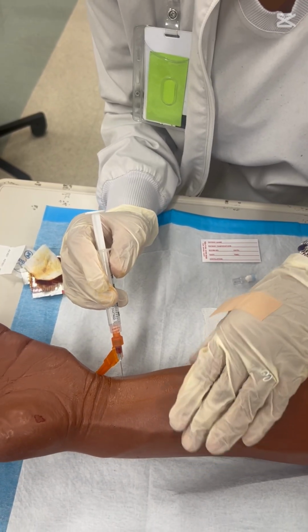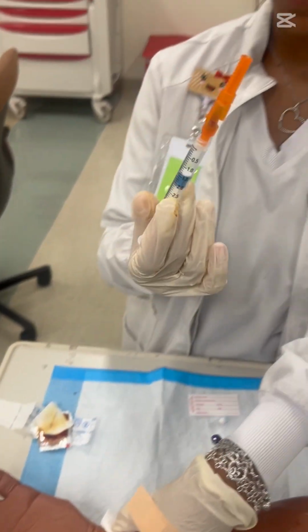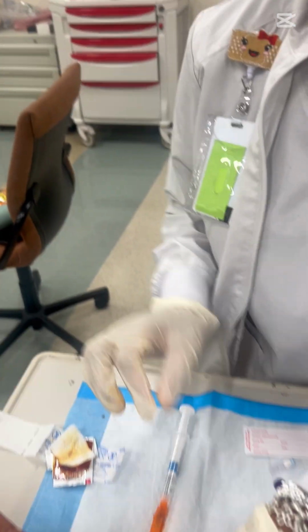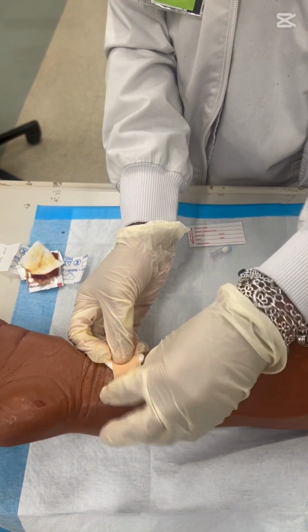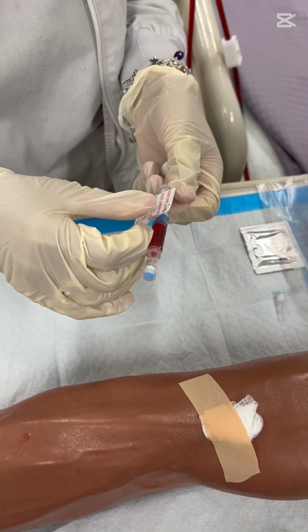After cleansing the site, you're going to want to insert the needle at a 45-degree angle, noting pulsations of the radial artery as blood fills and collects. You want to collect about 2 to 5 milliliters of blood. Next, you're going to remove it slowly and recap the syringe needle not with your hand, but using the table instead. Make sure that you have a gauze to hold for at least about 5 minutes to watch for any hemorrhaging and bleeding. You also want to make sure that there is a bandage over the puncture site.